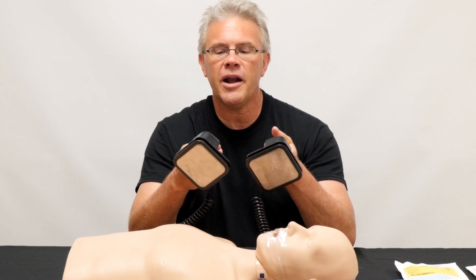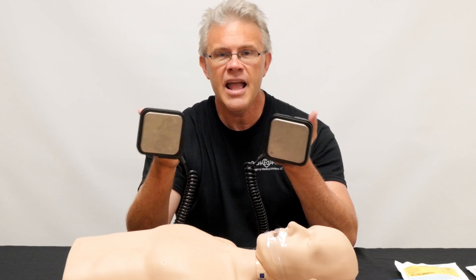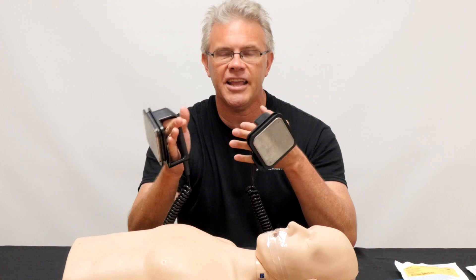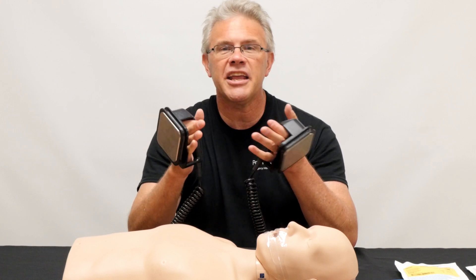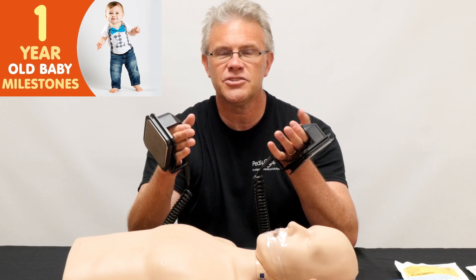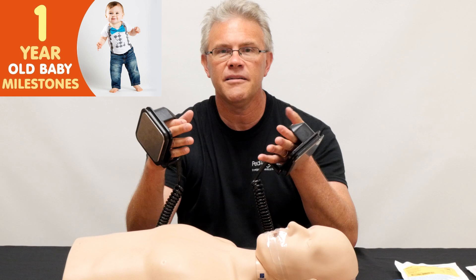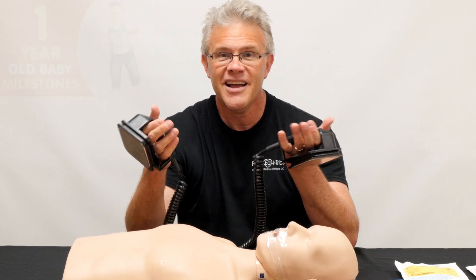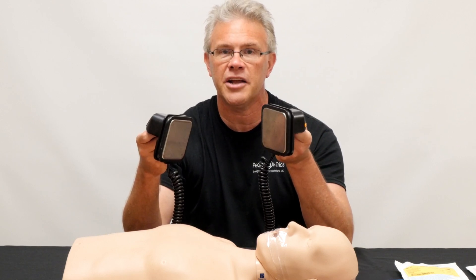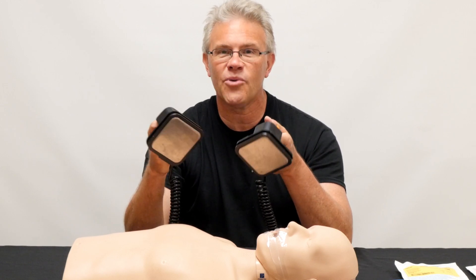Now the other neat thing when it comes to paddles is you use these for adults and for kids. In PALS, they say that if the kid is under one year old — otherwise known as under 10 kilos, or about 20 pounds — that's where they say if you have them, you can use the little tiny paddles, otherwise known as the pediatric or baby paddles. However, I've seen people frantically running around trying to find the pediatric paddles, saying 'I can't find them' — and that's because they're hiding.